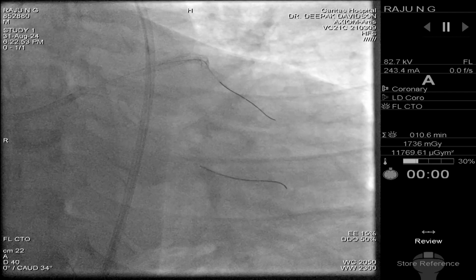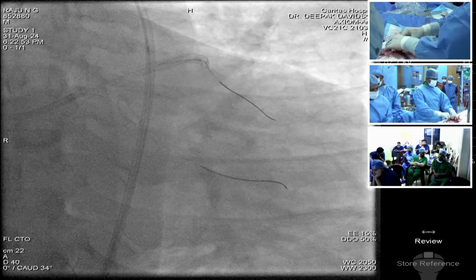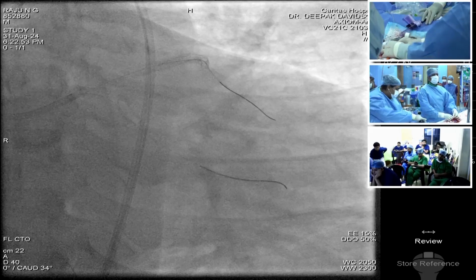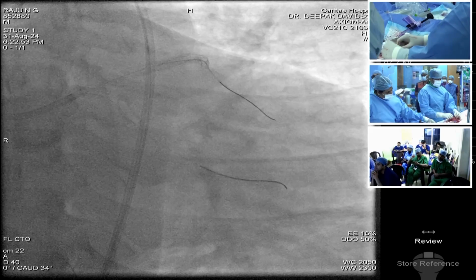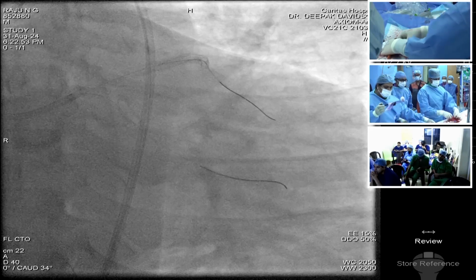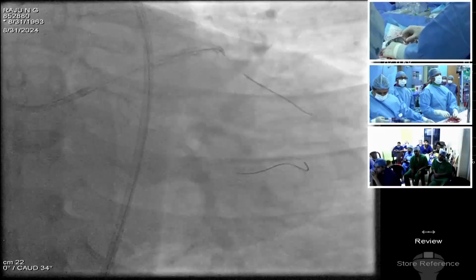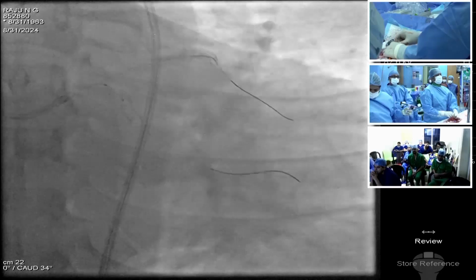And then a 3.25 balloon for dilating the LAD. Yes, 8 or 10. Or at least we need 12, because we need to use that as a crushing balloon. If you take an 8 millimeter balloon for the crushing, it will melon seed. So 3.25, 12. OCT-wise, we felt that the proximal LAD is 3.5. So for the pre-dilatation we don't have to use a 3.5; we'll try it with a 3.25.